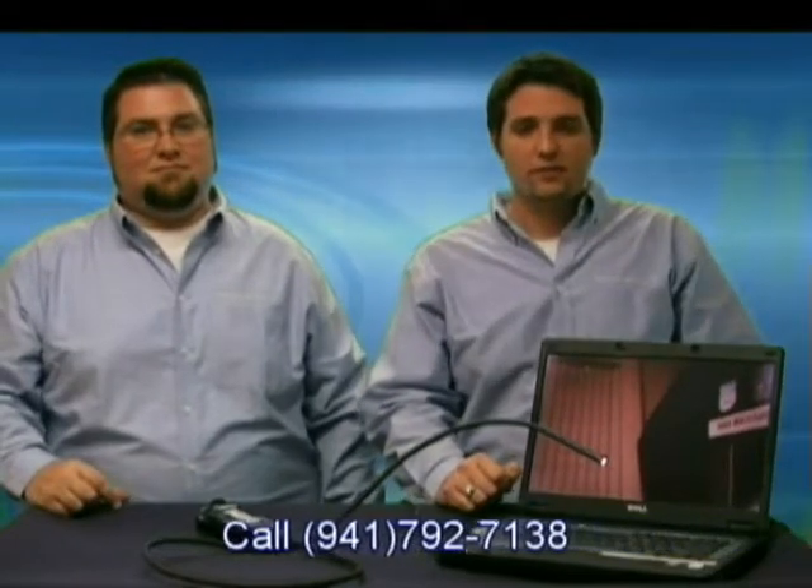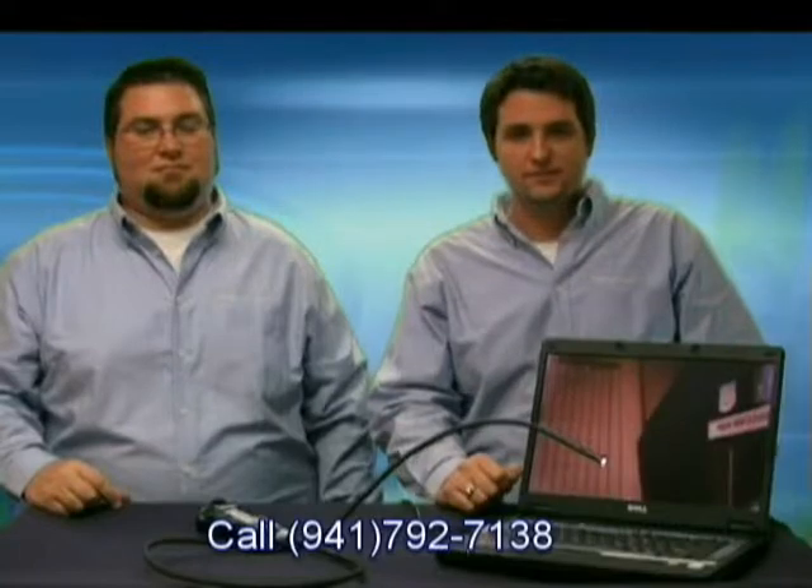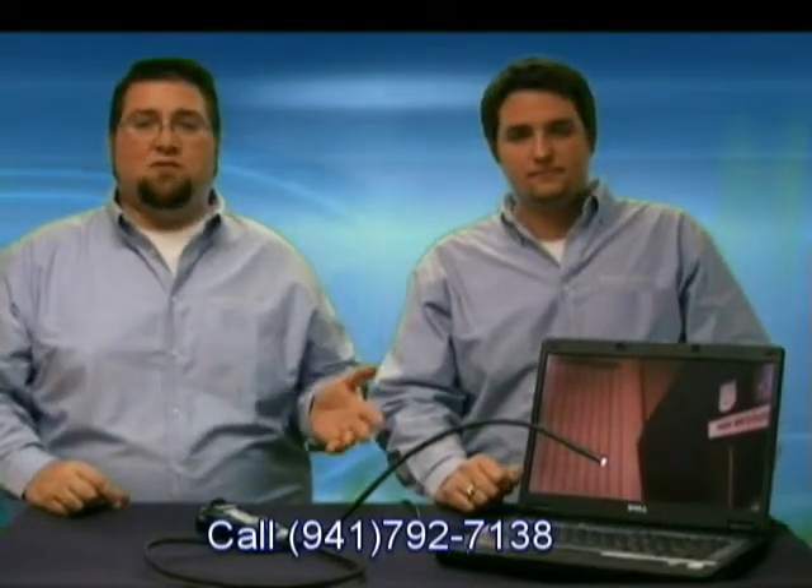Today we are using a laptop running on the Windows XP platform. The scope is also compatible with Windows Vista, and the scope comes with software to install on either platform. As we mentioned before, this scope can be used for veterinary use, especially equine.